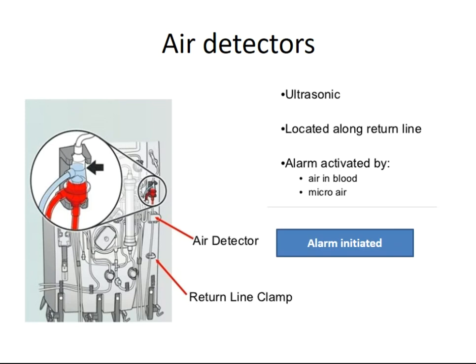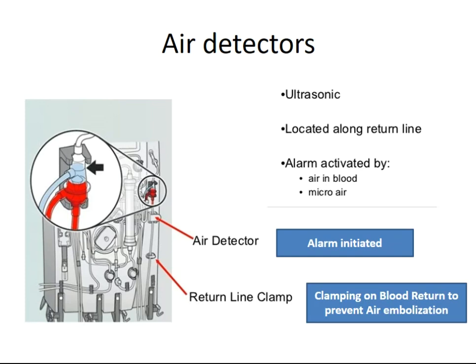When the alarm is initiated, there is clamping on the blood return side to prevent air embolization. An essential safety step.